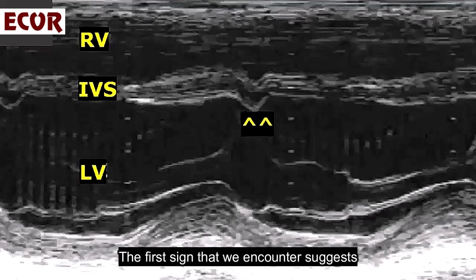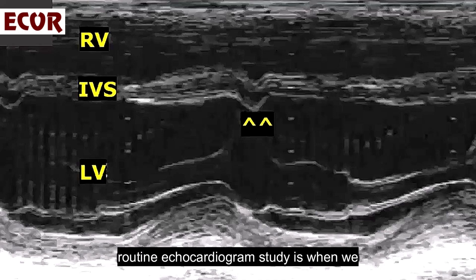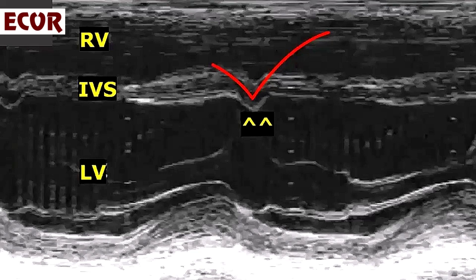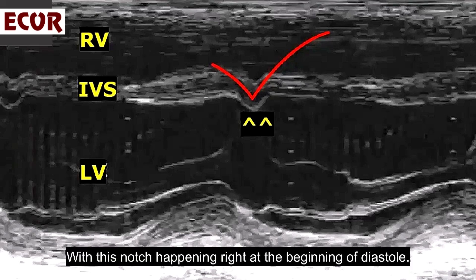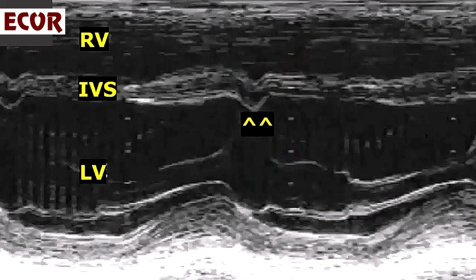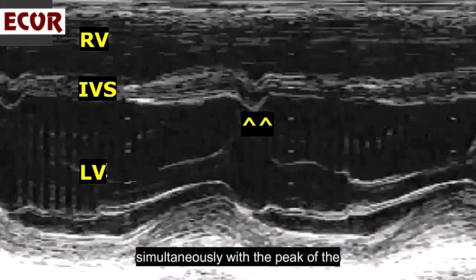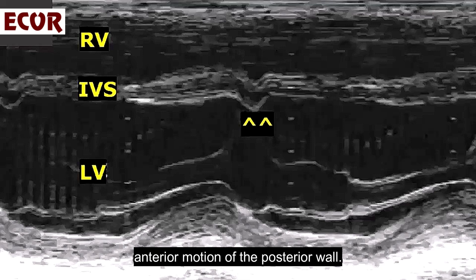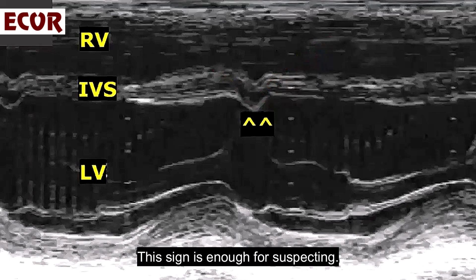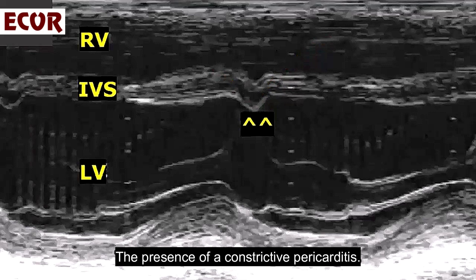The first sign suggestive of constrictive pericarditis encountered during a routine echocardiogram is when we take an M-mode to measure the left ventricle and find a characteristic paradoxical IVS motion with a notch occurring right at the beginning of diastole. Different from the normal notch, it is very sharp and has an aspect like the letter V. This sign alone is enough for suspecting the presence of constrictive pericarditis.